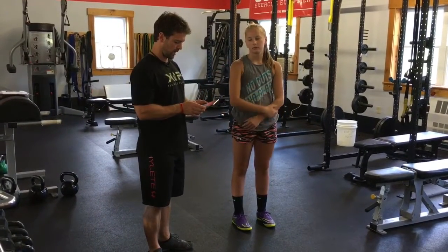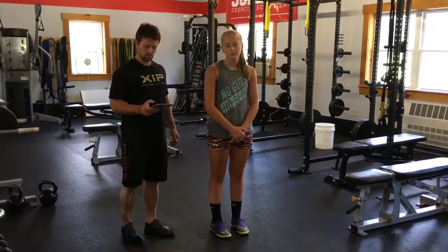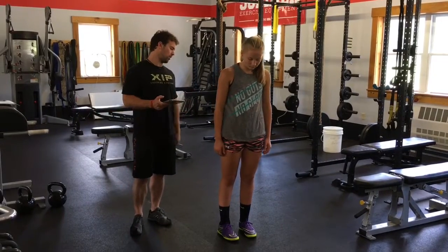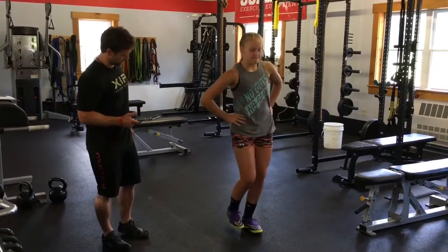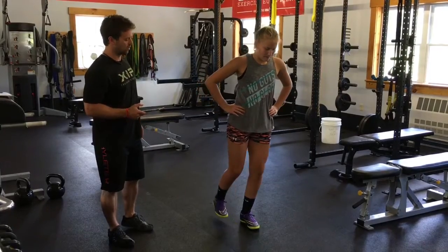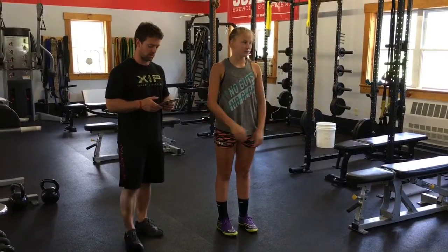We had an average speed of 0.77 meters per second. Right leg's done. Now we're going to move on to her left. Go ahead — hands on hips, dip and drive, get up. Relax. Reset. Drive with everything you've got, let's go. Good. Relax. Now we'll look at the left side.